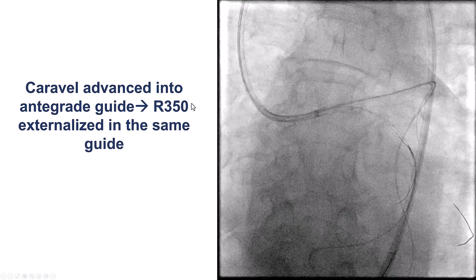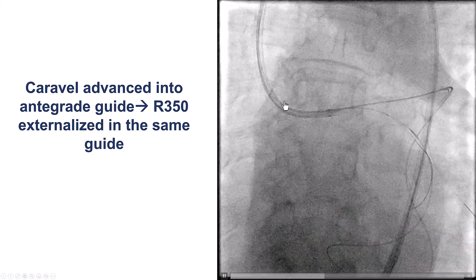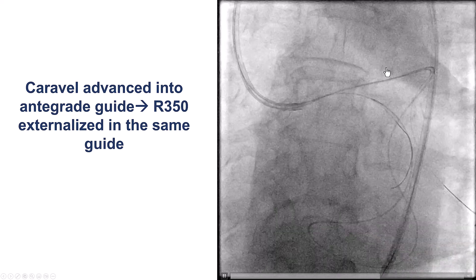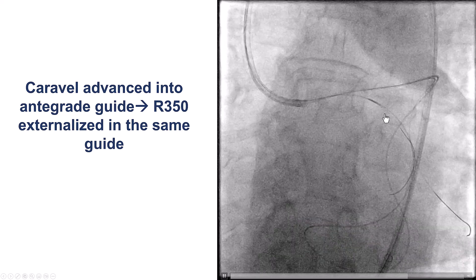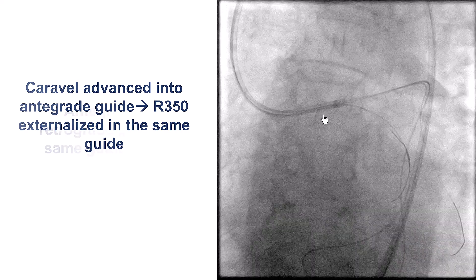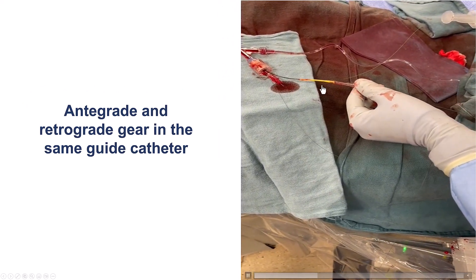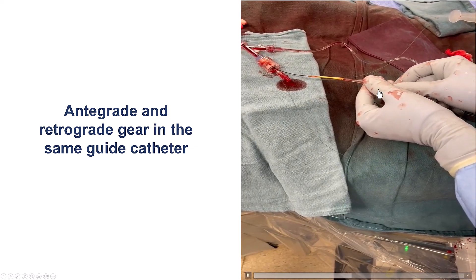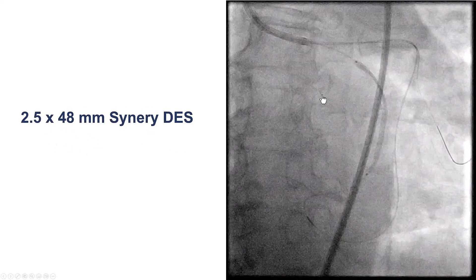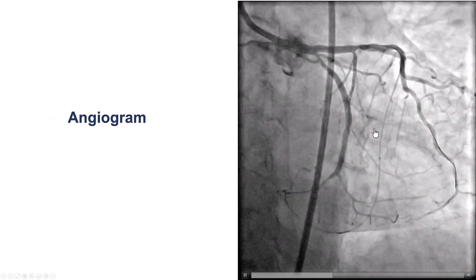We were able to advance the retrograde microcatheter into the antegrade guide catheter. The situation here was that everything was done through the same guide catheter — a single guide with the microcatheter going through the collateral and distal true lumen, then the wire and microcatheter coming back into the same guide catheter. We externalized the guide wire through the same guide catheter using the Caravelle, then predilated and stented with a long drug-eluting stent.